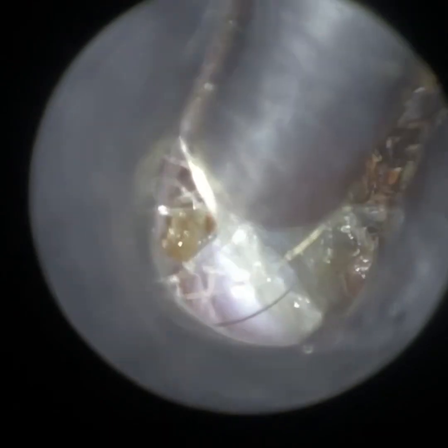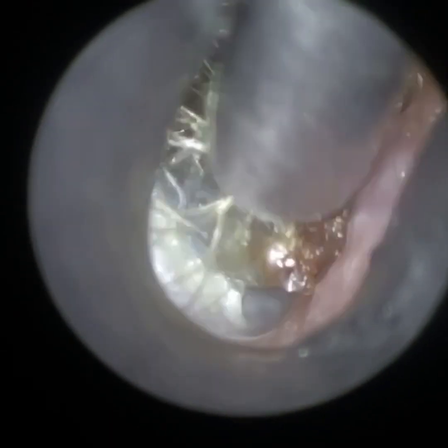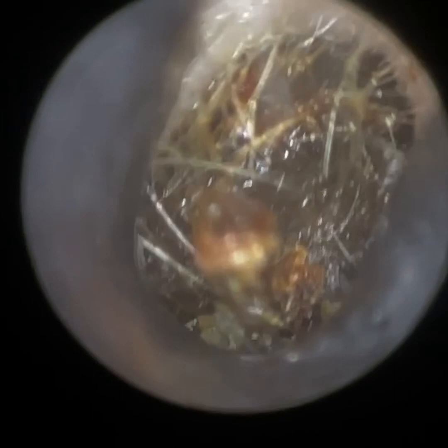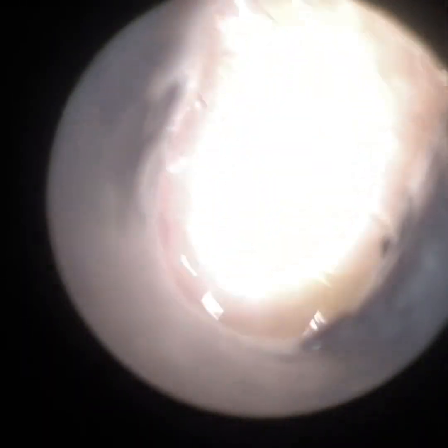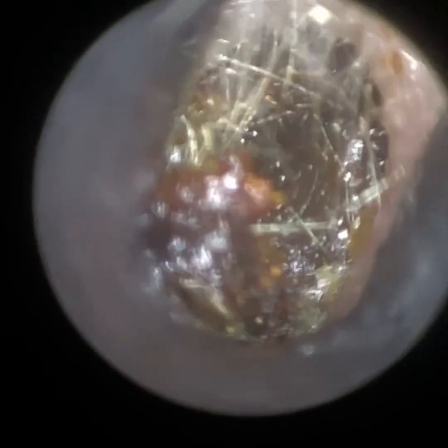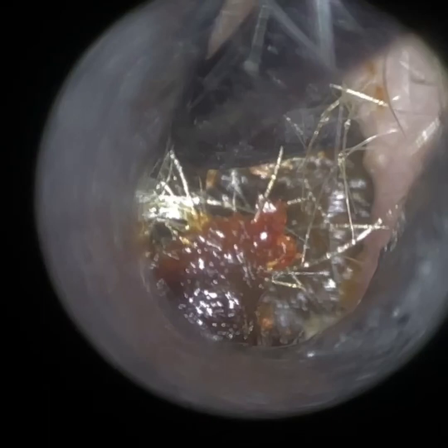When I visualised the eardrum, it was very difficult to distinguish all the usual landmarks. For that reason, I went back in with the iClearScope just to get a perspective, and I was quite impressed by what the Waxscope delivered in that sense. What you will notice is right at the end of the video, when you watch the post-procedure examination, is that this patient's got a very, very bendy medial part of the ear canal — and I'll come back to that in a moment.